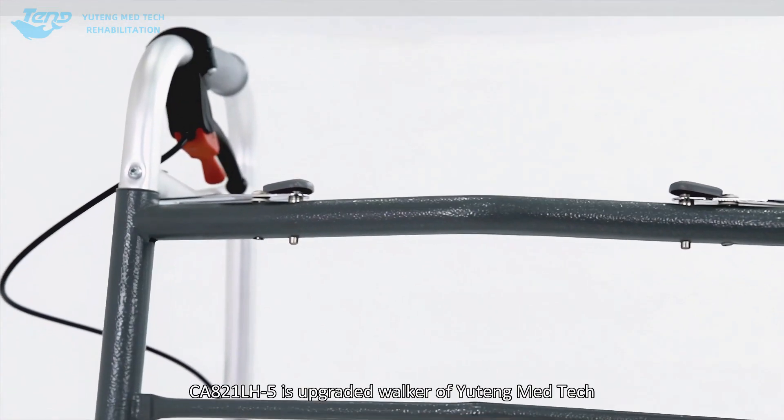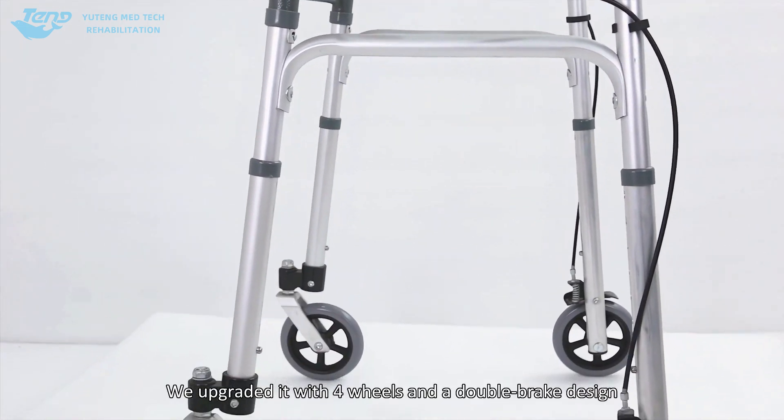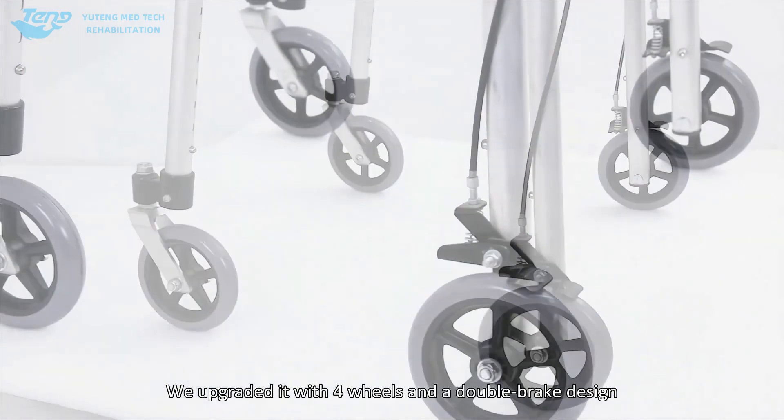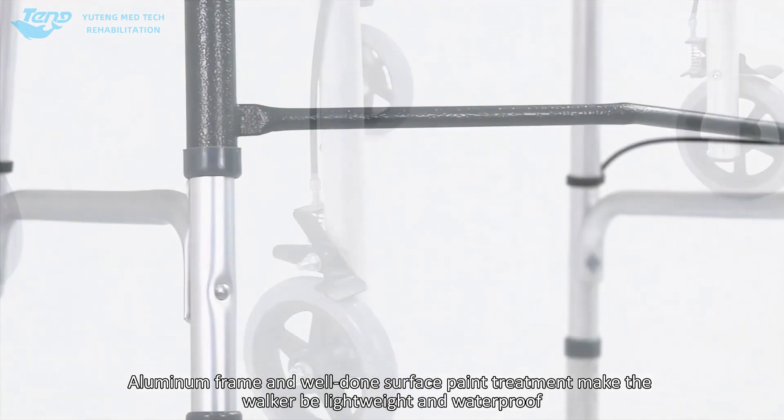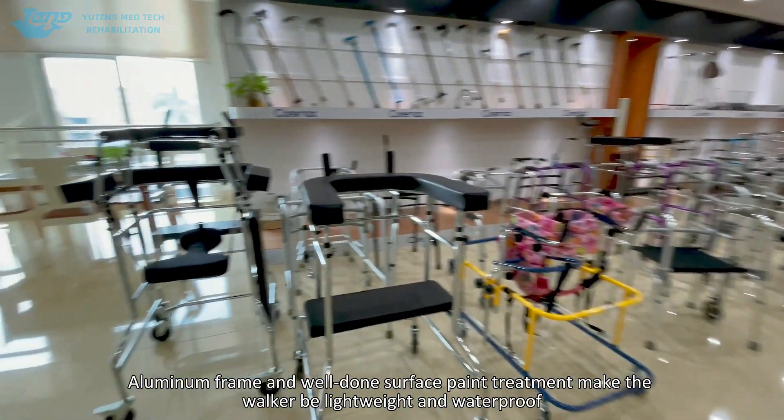CA821LH5 is an upgraded walker from Uding Med Tech. It's a two-button release walker, upgraded with four wheels and a double-brake design. The aluminum frame and well-done surface paint treatment make the walker lightweight and waterproof.